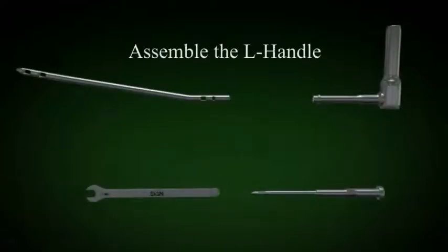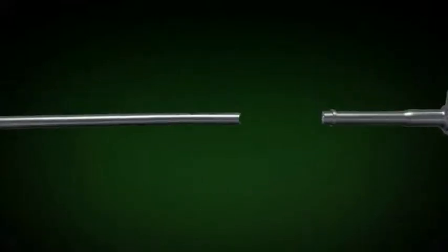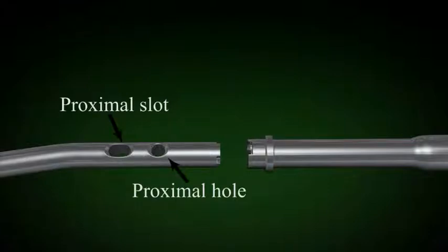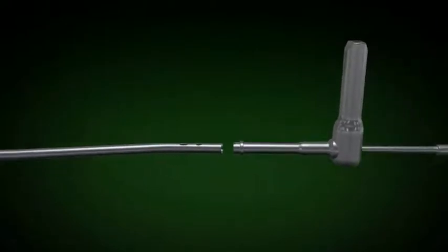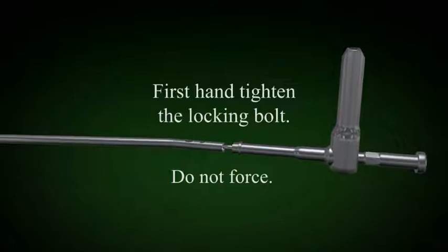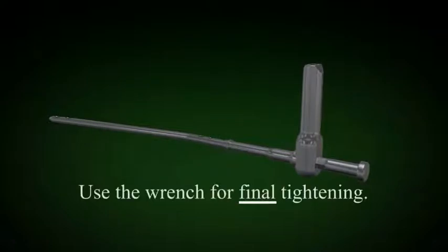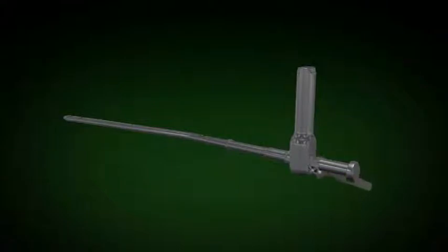The nail is then set up using the locking bolt and the L handle. Note where the curve of the nail will be when you set up the locking bolt and L handle. In the antegrade approach, set up the locking bolt, L handle, and nail so that the proximal bend is directed anteriorly. In each approach using the SIGN nail, the orientation of the proximal bend of the nail is different. Tighten the locking bolt using the wrench and check this periodically throughout insertion of the nail.